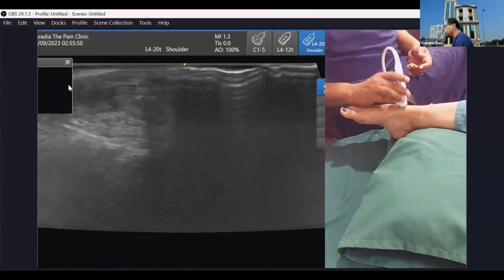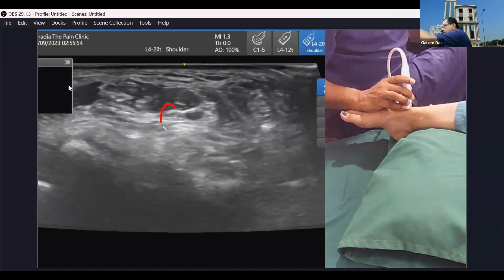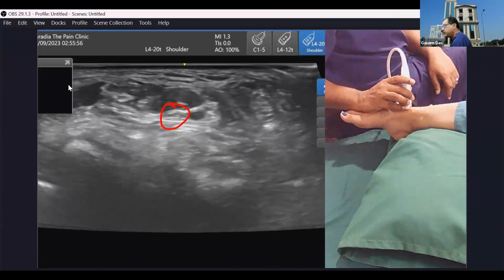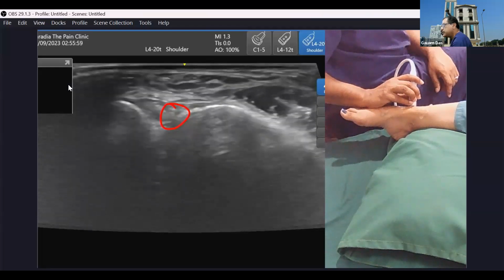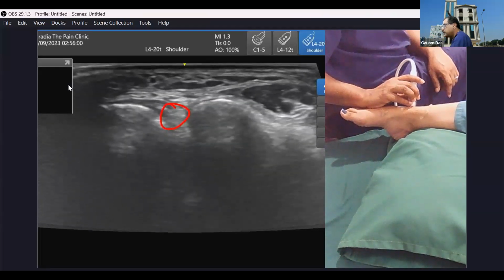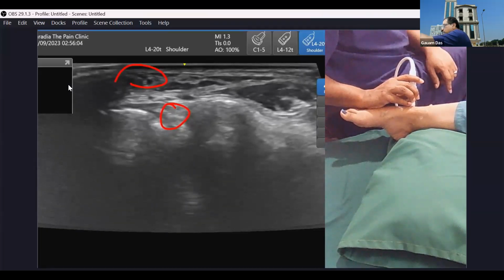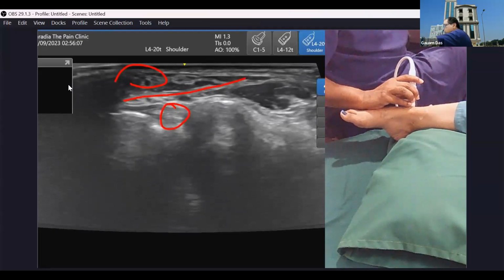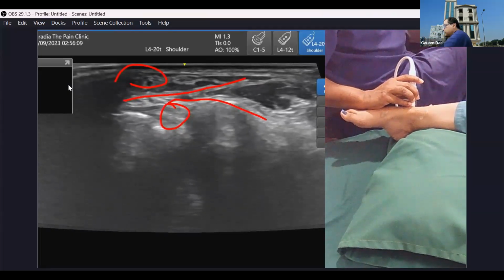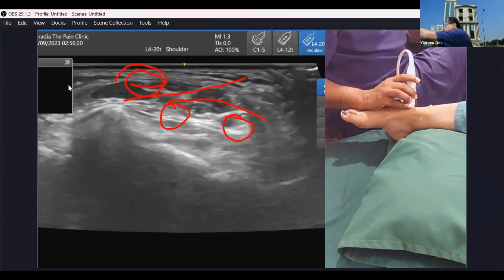Okay, and you have also already seen the nerve there. This was the deep peroneal nerve. Superficial peroneal nerve you can also see here. This was your retinaculum which is getting divided. So this nerve is above the retinaculum, whereas this nerve is below the retinaculum. This is your superficial peroneal, and this was your deep peroneal.